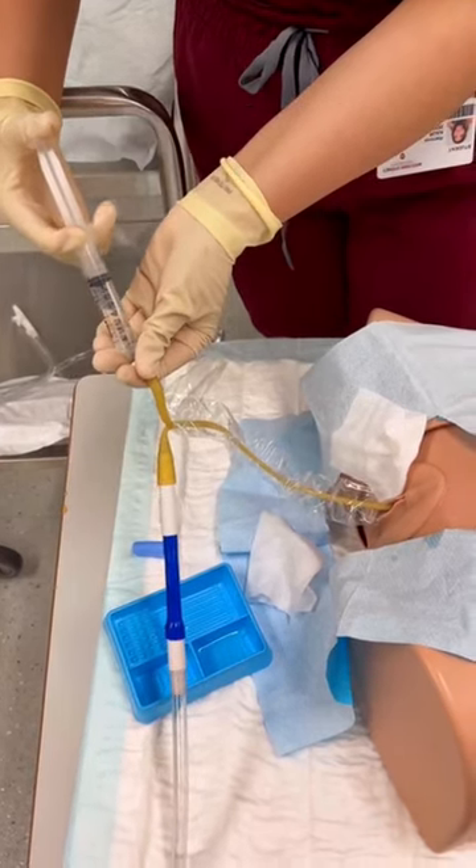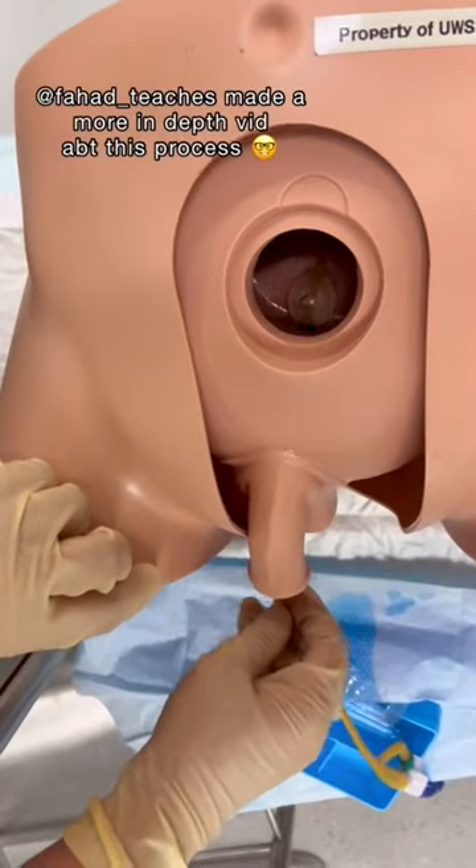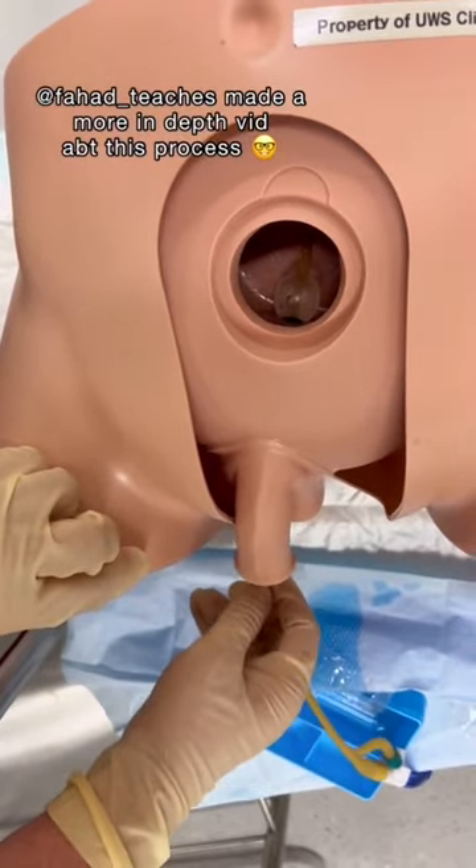Finally, I'm just inflating the catheter balloon with some water. This basically stops the catheter from sliding out. So if you've ever had a catheter, you've had a tiny balloon inside of you. Here's what it looks like.